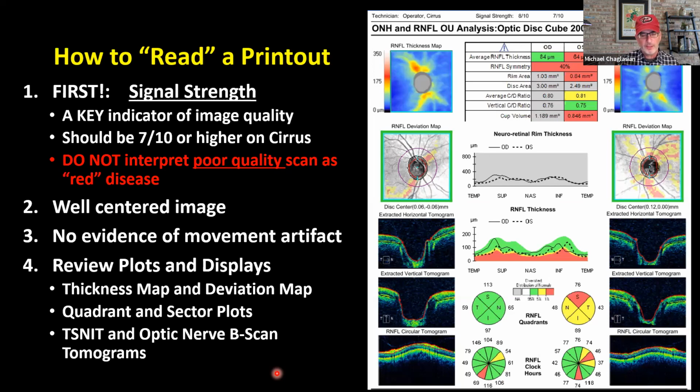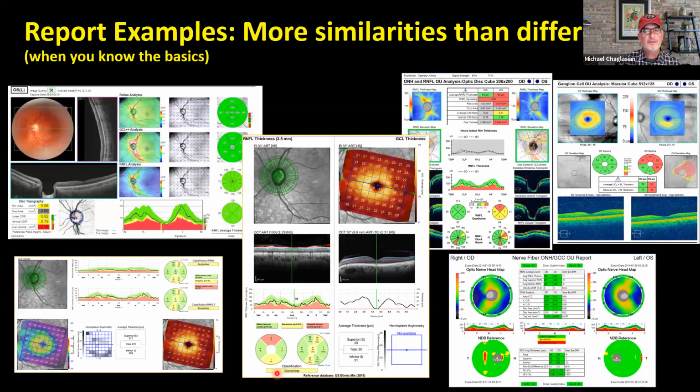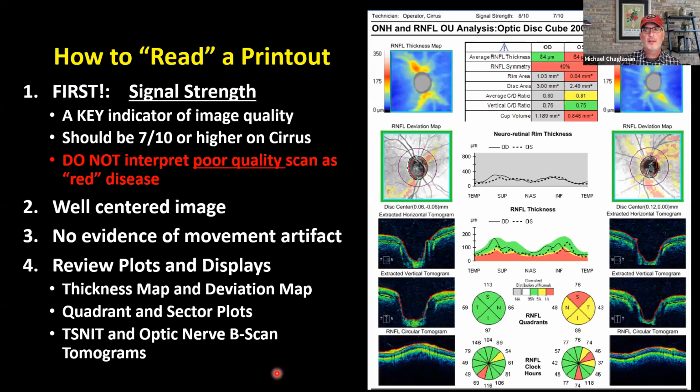And that's another hindrance, I guess I should mention, why the devices differ so much, is that many parts of this report, if not all of them, require FDA approval. And so submitting the data to the FDA and getting it approved to present to a practitioner is a hurdle that some companies choose to pursue in different degrees and with different intensities and dedications, if you will.